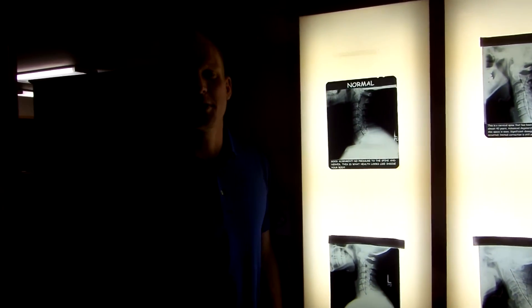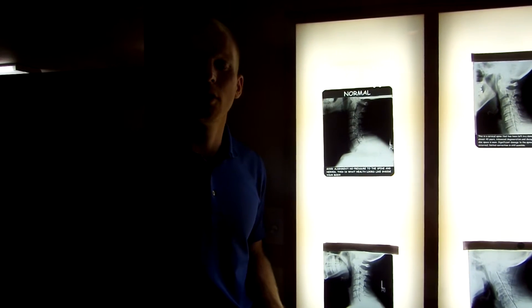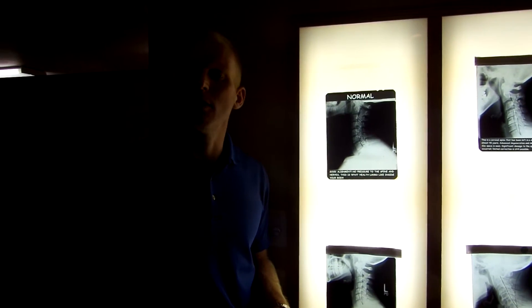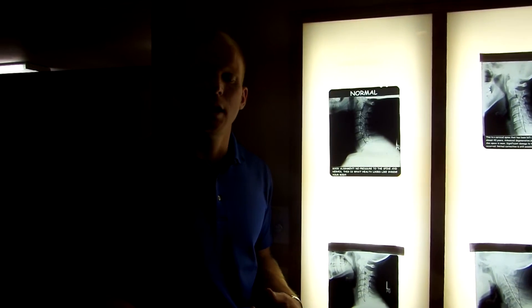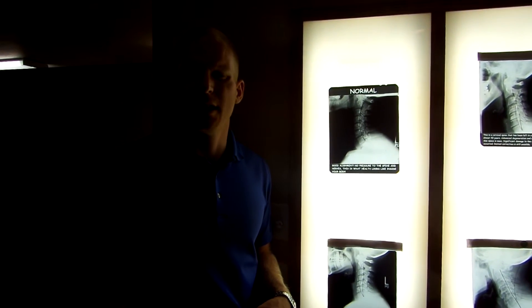Hey guys, Dr. Bergman here again at Rosemary Jones Chiropractic. This week we're going to show you some x-rays, some real life x-rays. Last week we had talked about the phases of degeneration and how that can affect the nerve. Today we're going to look at the x-rays and show you what it actually looks like when we take a picture of our patients and talk about some of the symptoms that they've had as well.